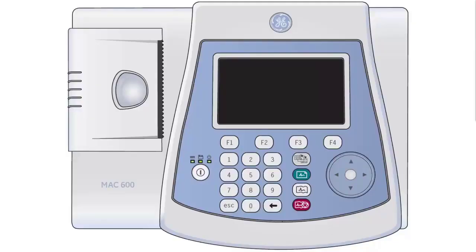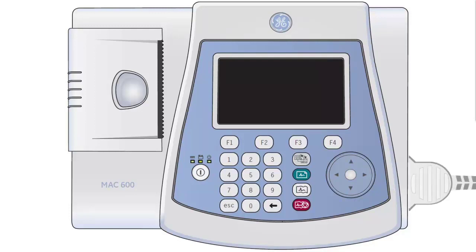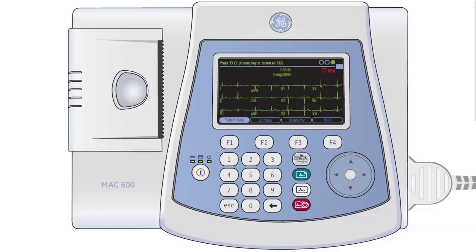Once all patient preparation and hookup is complete, connect the patient cable to the connection socket on the right hand side of the Mach 600. Switch on the Mach 600 using the power button located on the left hand side of the number pad.